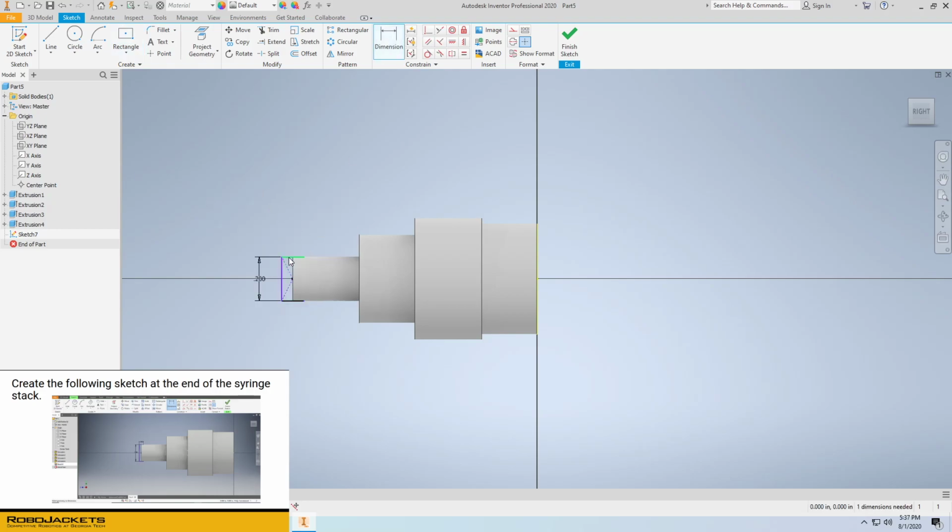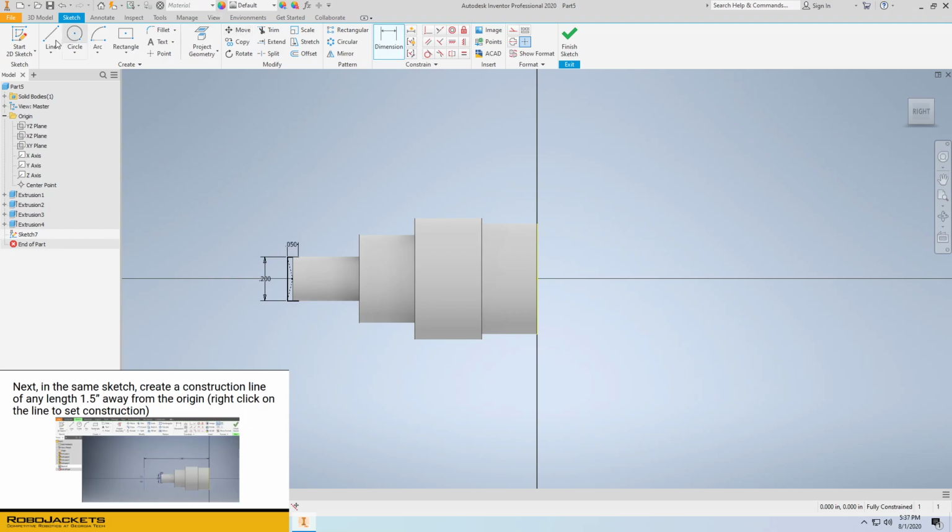Go ahead and dimension this right here. Now, we'll create a construction line. The length doesn't matter, only that it be vertical. Distance, 1.5 inches from the y-axis. Go ahead and set that to a construction line, and that'll finish this sketch.